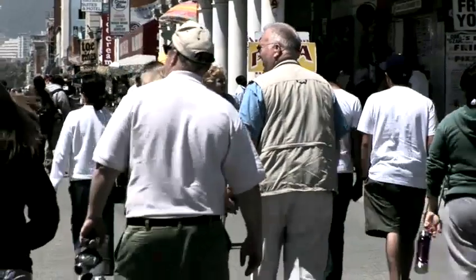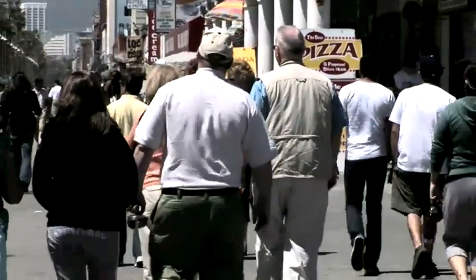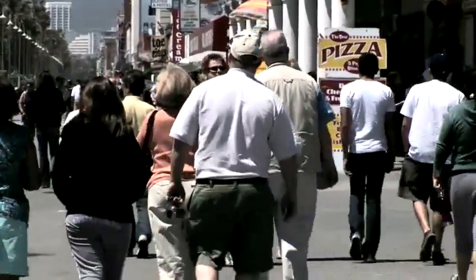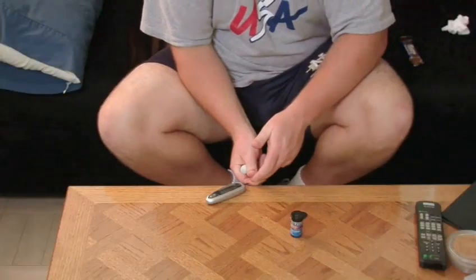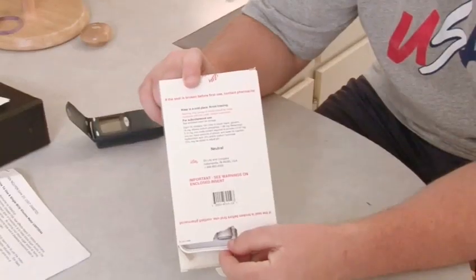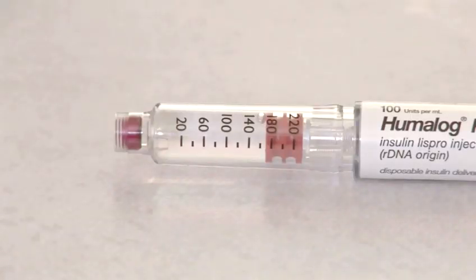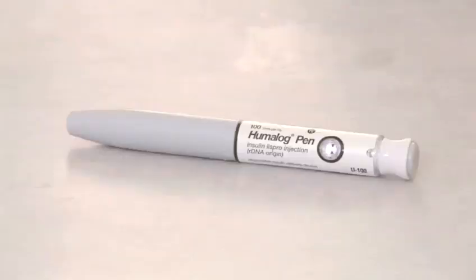Diabetes is a chronic disease that affects nearly 21 million Americans, with 800,000 new diagnoses every year. You can help control your diabetes with good exercise, but you may also need to monitor your glucose level and give yourself insulin injections. The newest insulin injection system is comprised of a vial of insulin and a disposable needle in the shape of a large marker called an insulin pen.